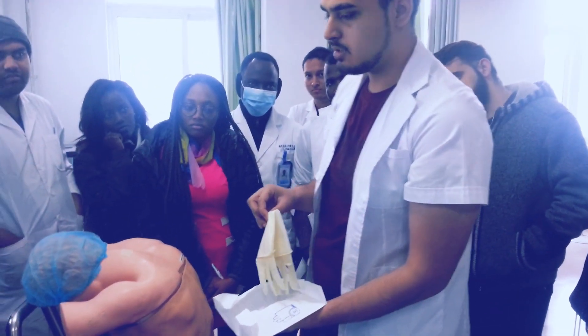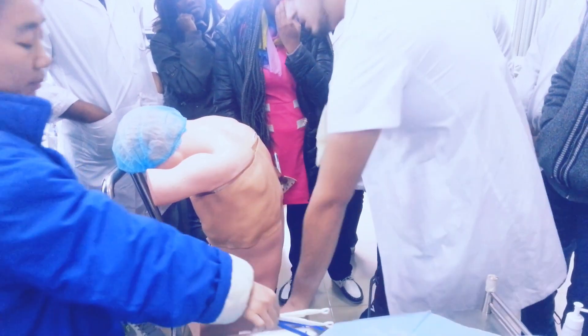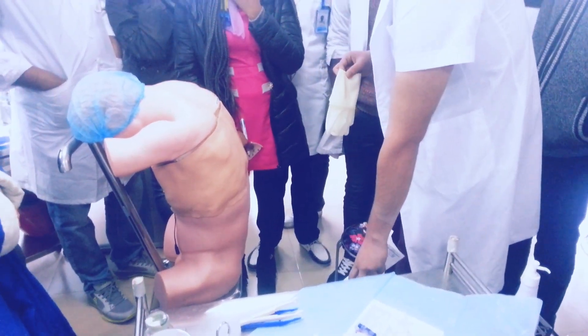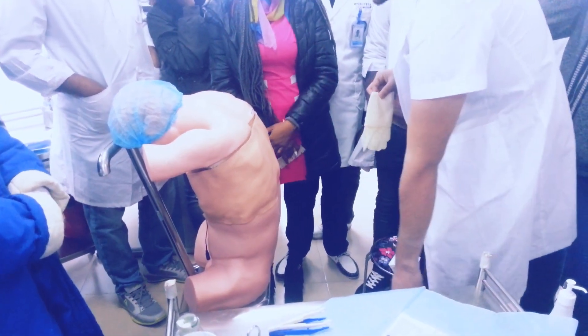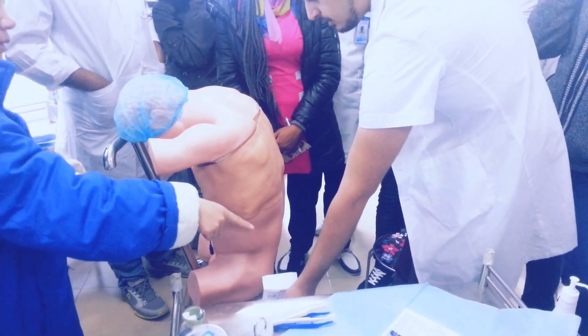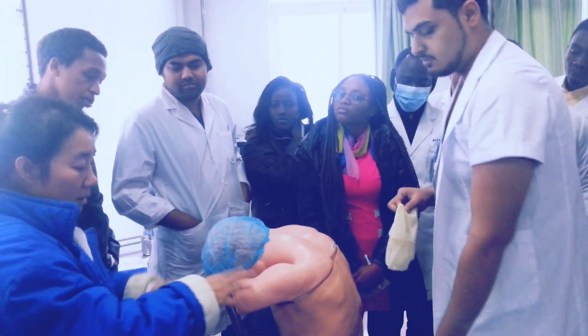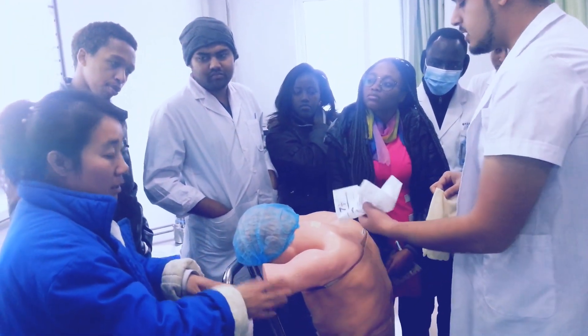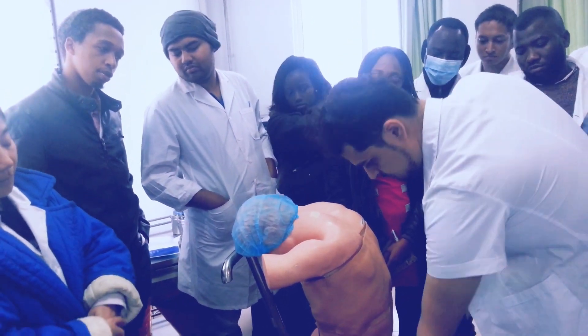Let's proceed now. For the most part, I will discard the used item here. This is for the instruments you use here — like injections and stuff. This is for the patient. Use on the patient — like the glove.